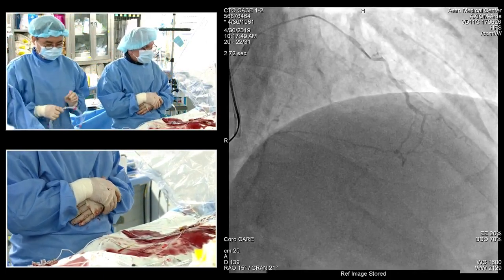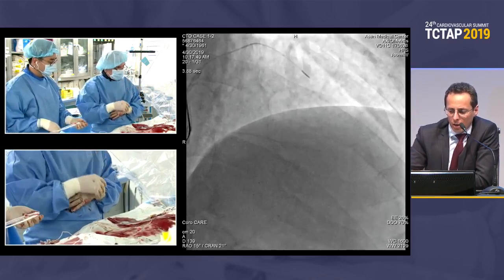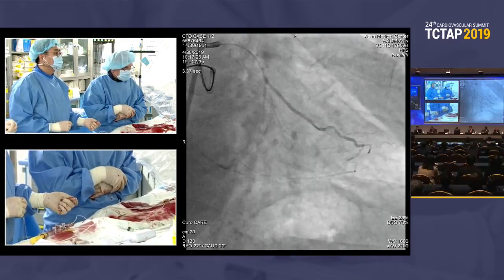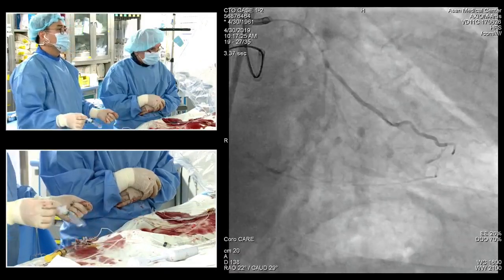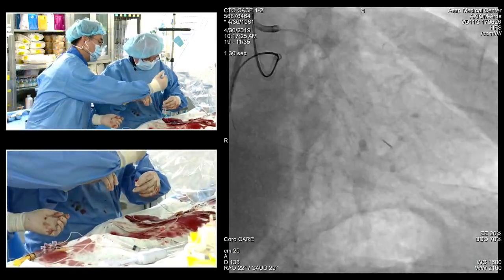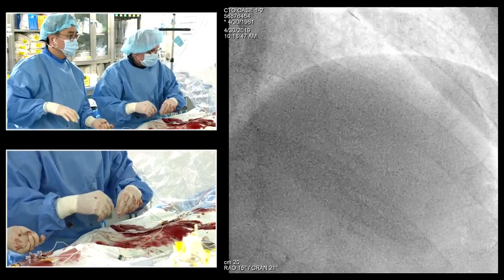What I don't understand on the entry here is the distal part of the connection. The entry seems to be very good, but then it seems to go down a little bit, up again. Probably we can't see it because of the quality. Here it doesn't look like that. Okay. For the less injurious chance, it's better to start with the SUO3. What wire are you using now? SUO3, as advertised.